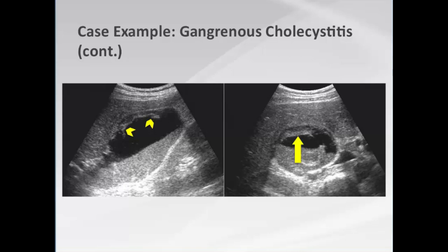Brought immediately to ultrasound, we see the sloughed mucosa giving intraluminal membranes, asymmetric wall thickening — allowing diagnosis of gangrenous cholecystitis — and a distended gallbladder with a fluid-debris level within it.